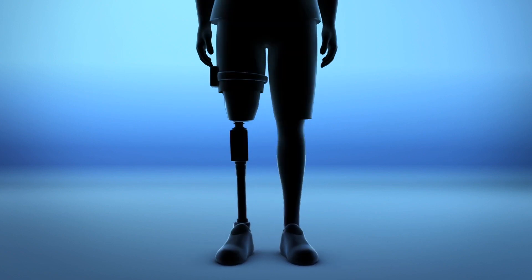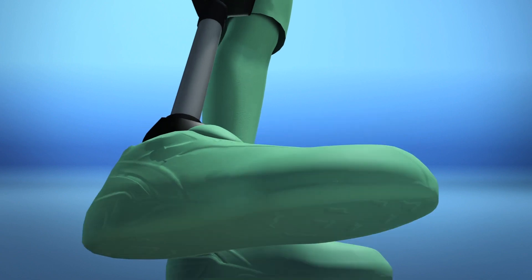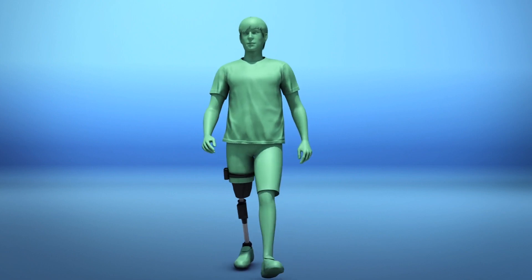Scientists implanted tiny electrodes into the amputee's residual nerves and placed an insole with sensors under the bionic foot, as well as sensors above the prosthetic knee. Signals were then sent to the residual nerves as the person walked.